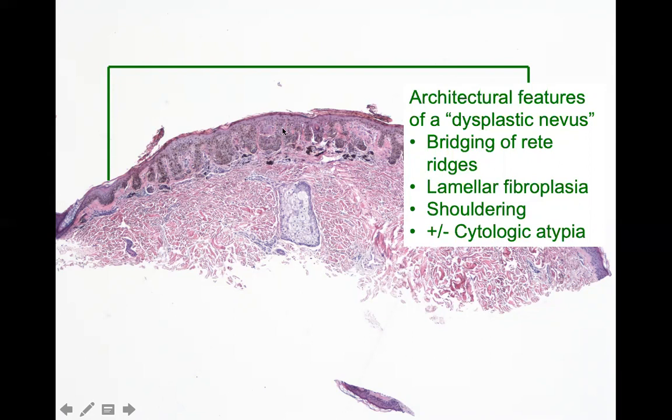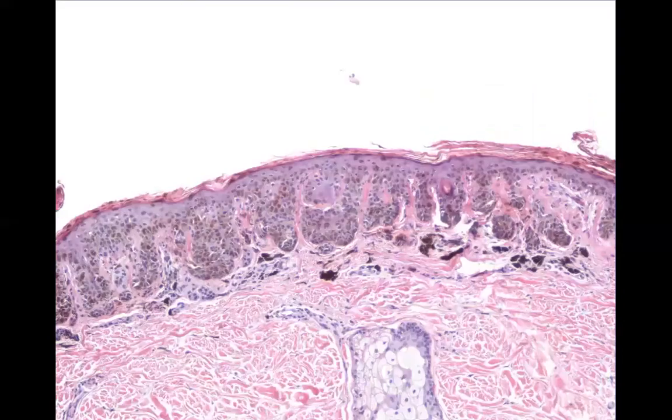So you can see this kind of dark halo around this. There's a bit of fibrosis, tissue reaction, a little bit of inflammation, pigment dropout. There's tissue reaction to this lesion because your body sometimes doesn't think it should be there. And then you may or may not have cytologic atypia. So this is kind of what was suddenly in that time referred to as a dysplastic nevus.